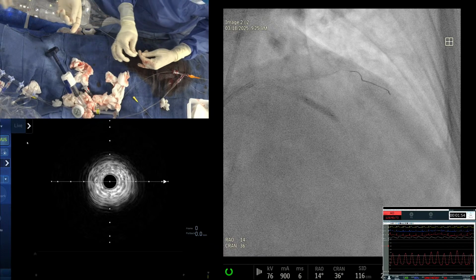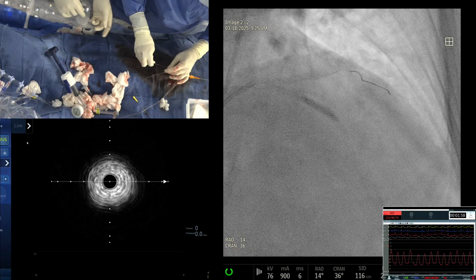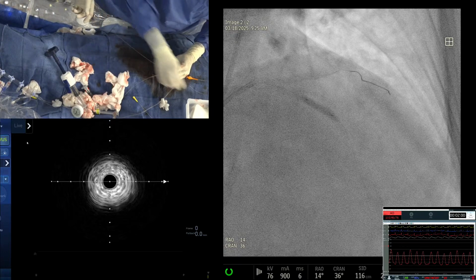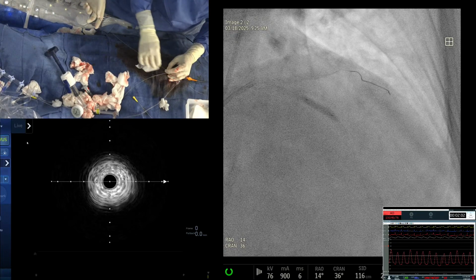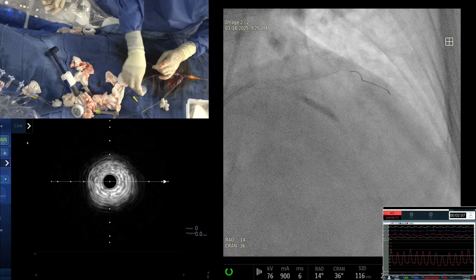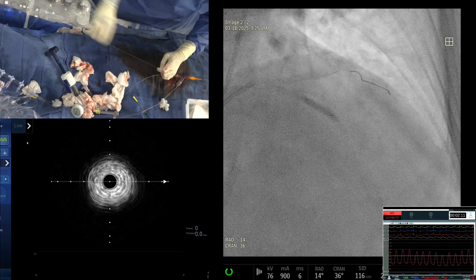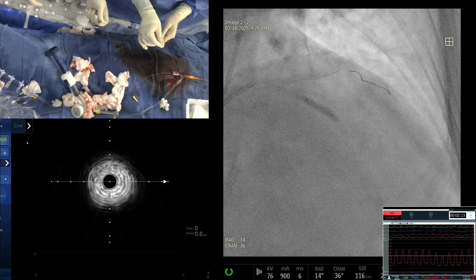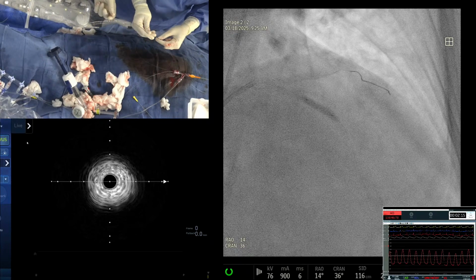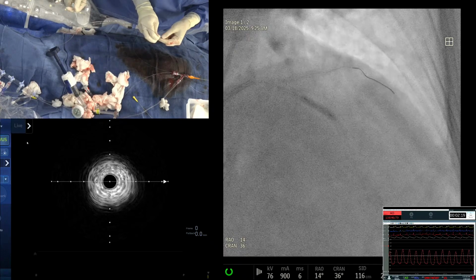Okay, now we are going with my board question, that nothing works here. What you do is Corsair, and after that the final answer for the exam would be laser, excimer laser. Although you can ultimately do the Rota also. I would leave everything the way it is. Looks good. Yeah, picture-wise things look good, right?